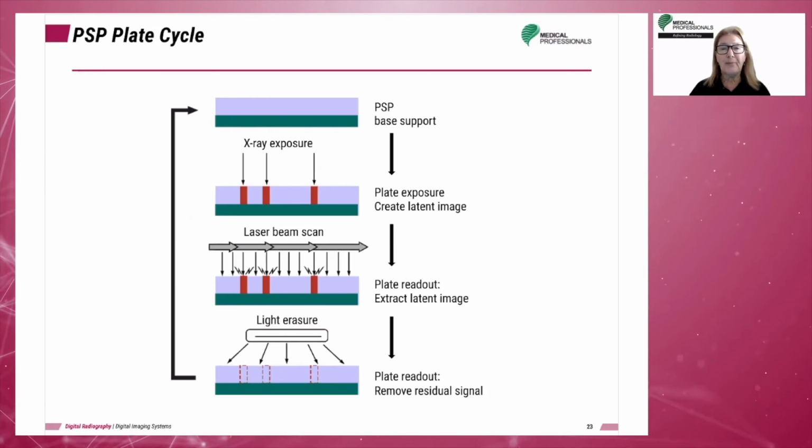Once used for a patient's exam, the plate should be scanned immediately or as soon as possible because it will begin to lose some of the energy that is stored, which is the image data. It is estimated that the plate will lose approximately 25% of the latent image in about 8 hours.